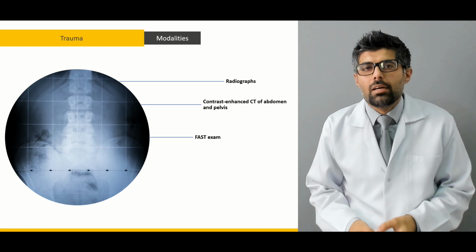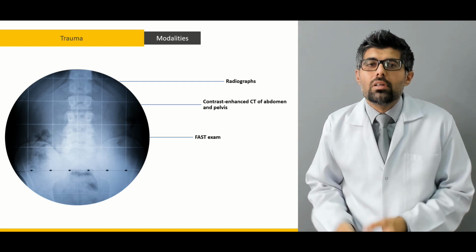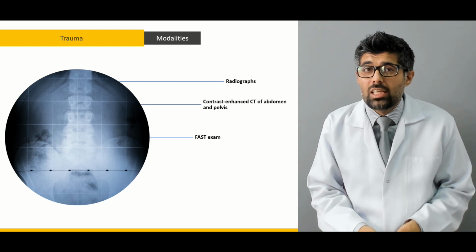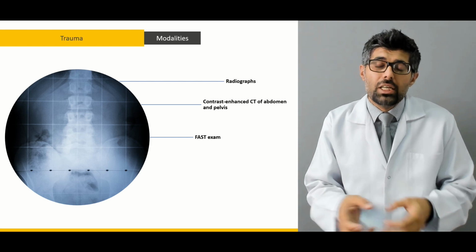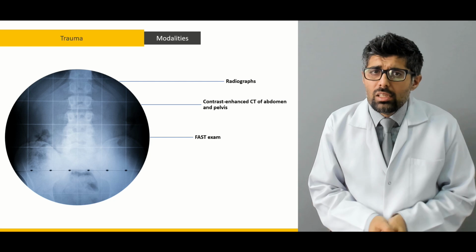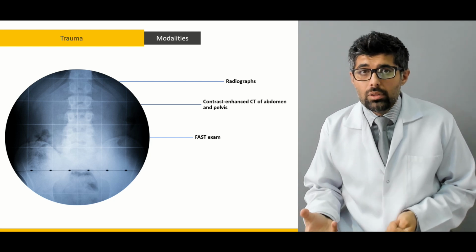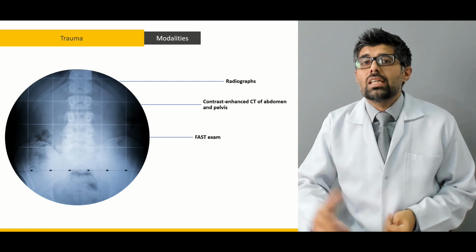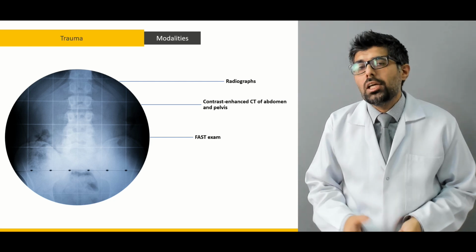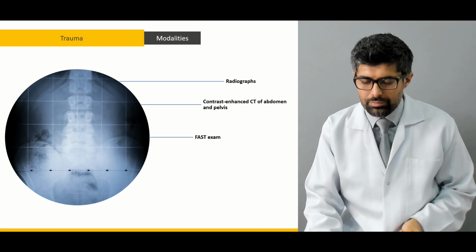But a FAST exam, because it's both portable and fast, can be done at the bedside while the patient is being treated. So not only is it fast, quick, reliable, it also gives us an internal view, especially in a blunt trauma. It is very, very vital.